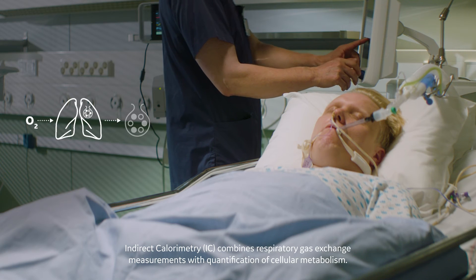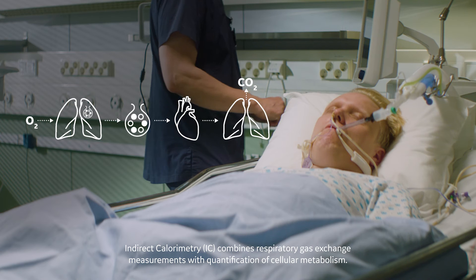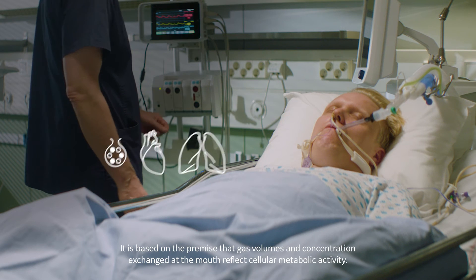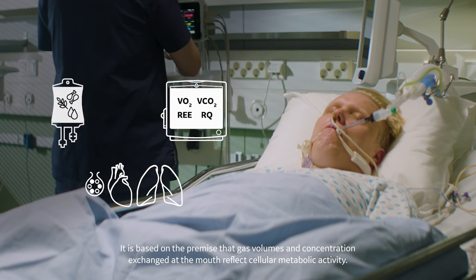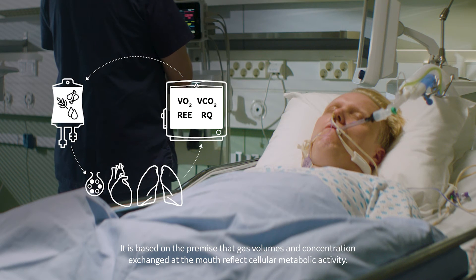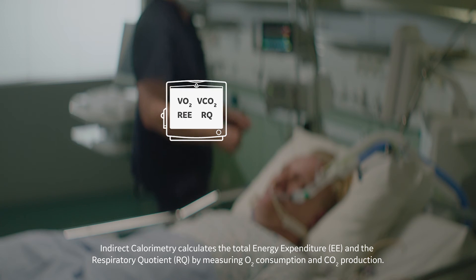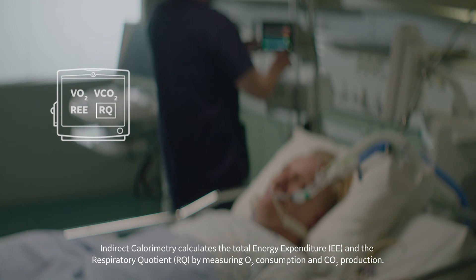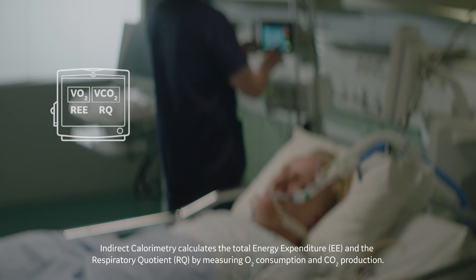Indirect calorimetry combines respiratory gas exchange measurements with quantification of cellular metabolism. It is based on the premise that gas volumes and concentration exchanged at the mouth reflect cellular metabolic activity. Indirect calorimetry calculates the total energy expenditure and the respiratory quotient by measuring O2 consumption and CO2 production.